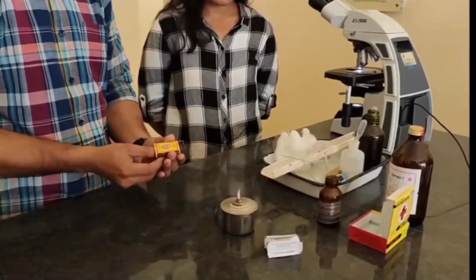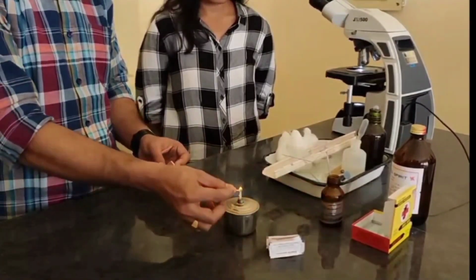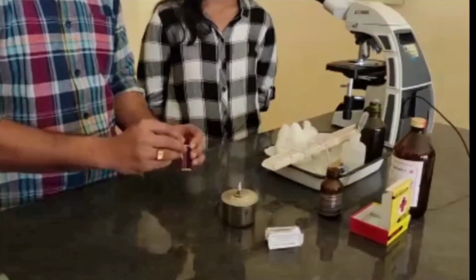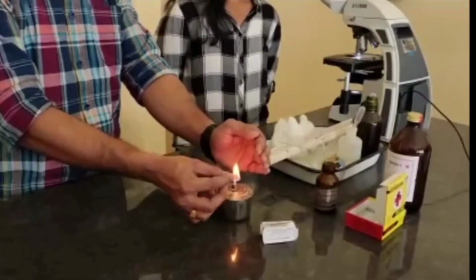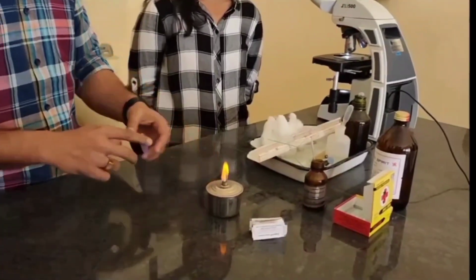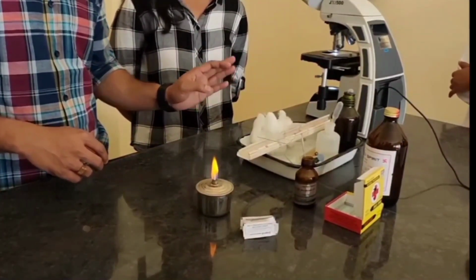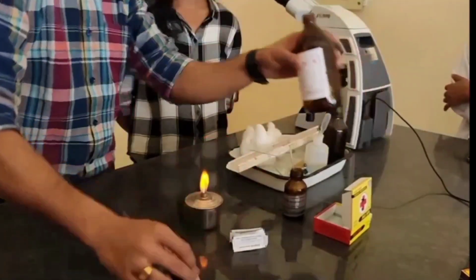Here I am going to show you how to reuse an old slide. First of all you have to clean your slide with soap and water, wash it nicely, and then make it grease or oil free. But if you are going to use a new slide, then you don't need to wash it or clean it over the flame. So this is the spirit lamp. The flame is here, and this lamp is filled with spirit.